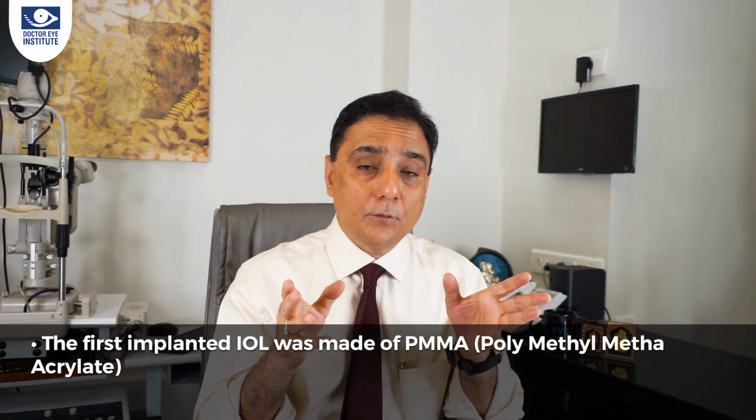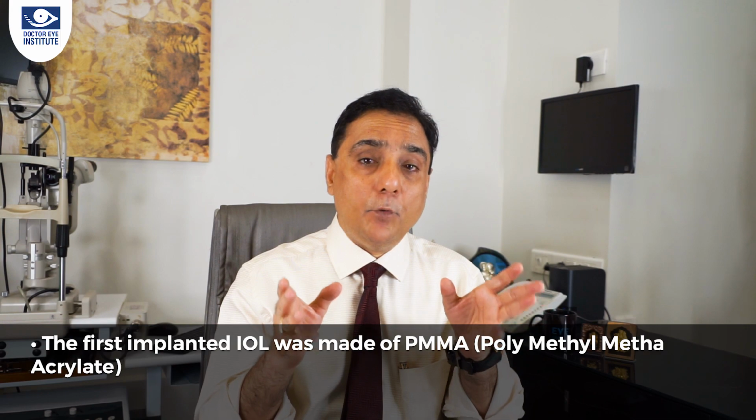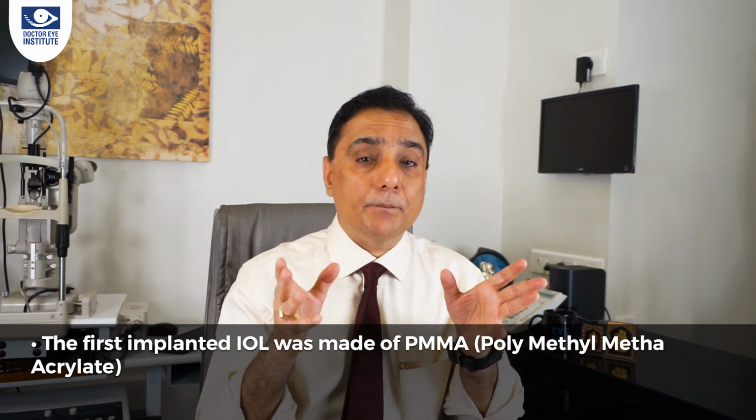He actually got this idea when one of his students asked him, sir, you're removing a cataract, why not place an artificial lens at the same position so that the patients can see? So Sir Harold Ridley performed his first surgery on a human eye in November 1949 in a 45-year-old lady who had cataract only in one eye. The lens that he implanted was made of PMMA, polymethyl methacrylate. It's a plastic which is known to be inert to the human eye.